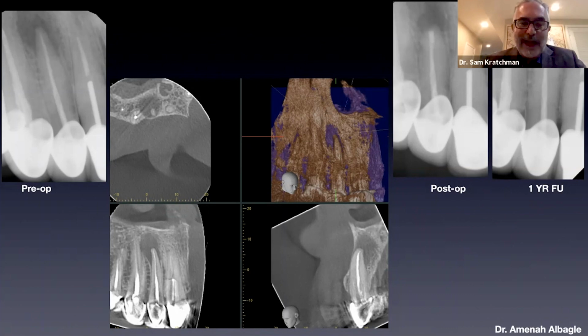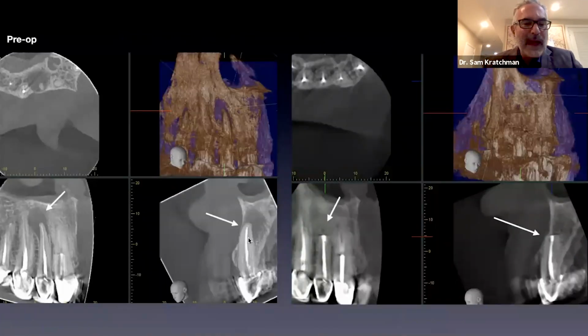And we wanted to track healing with the foundation, and more importantly, not just healing, but whether you're going to reform the cortical bone, as I said, which is the most important part and often the most difficult part. So here is the pre-op. This is cone beam slices, post-op, 1 year follow-up. Look at the comparison between the lesion here and the healing at 1 year, great.